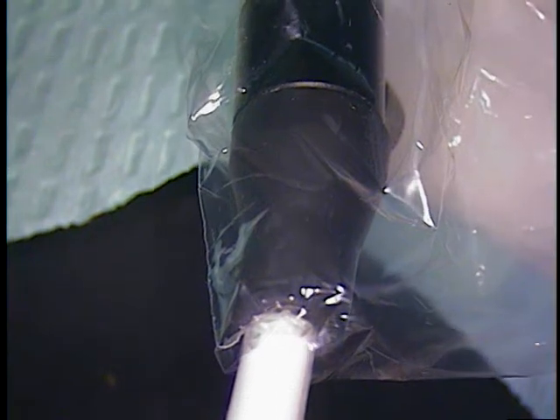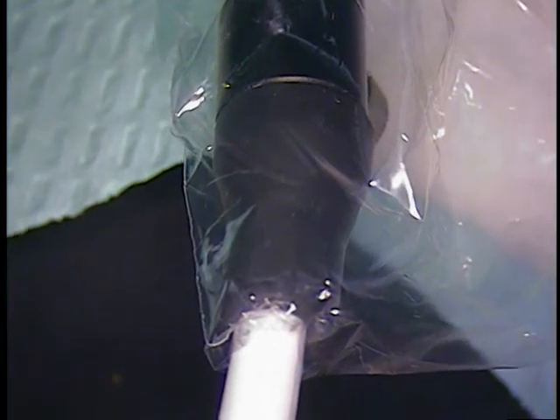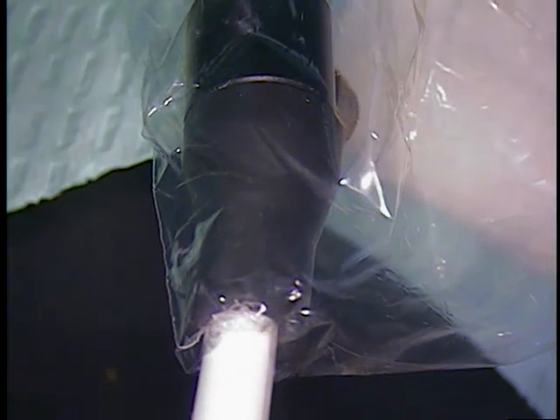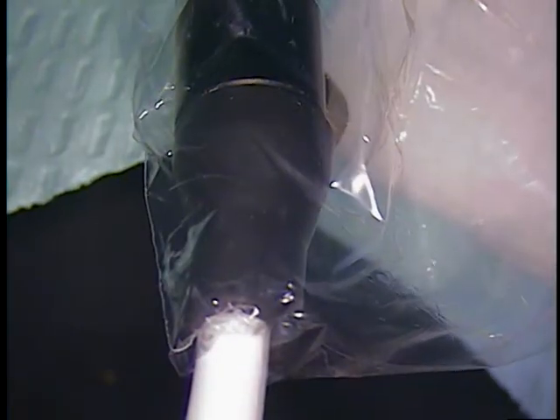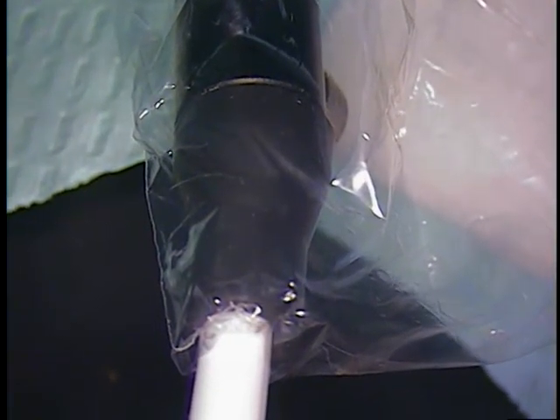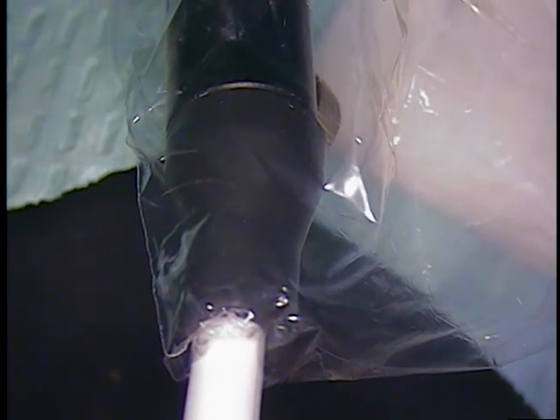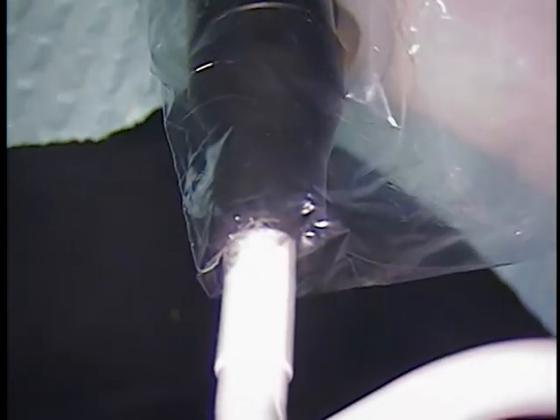Now the cleanup. So now we're going to pre-soak everything, and we got to use these little scrub brushes. First things first, the smallest scrub brush we have is a micro brush. We're going to flood the area first with tartar and stain. We're going to see what else floats up to the top. I'm going to try to stay away from peroxide a little bit because the blood that's in the shaft starts to bubble up. We have issues.